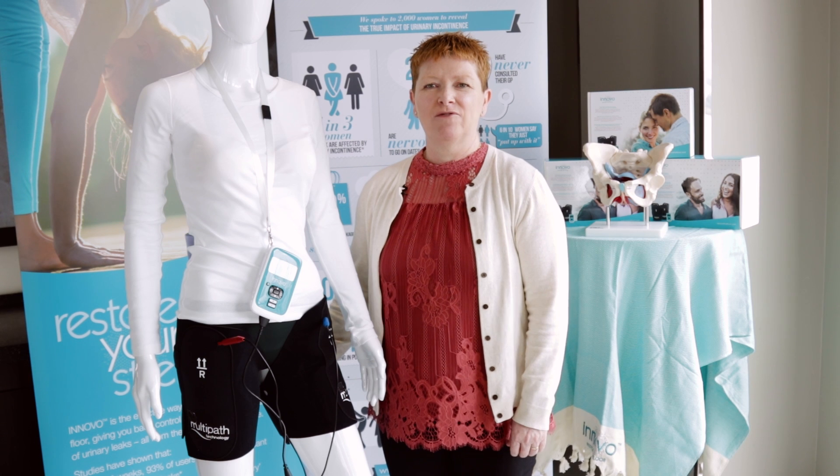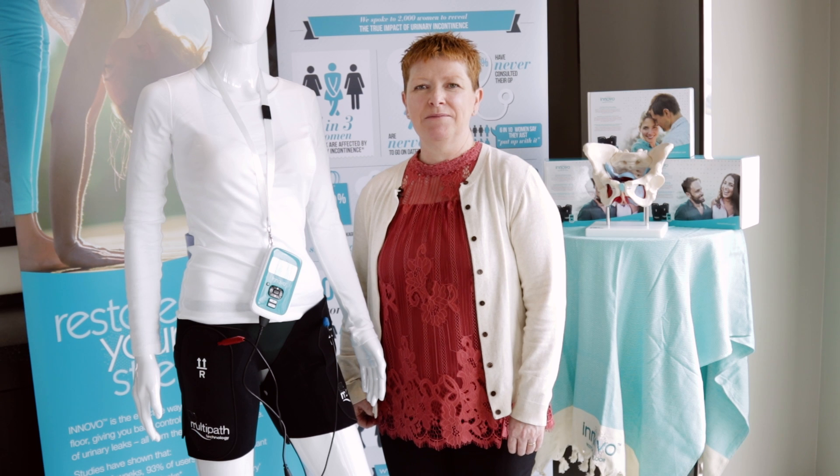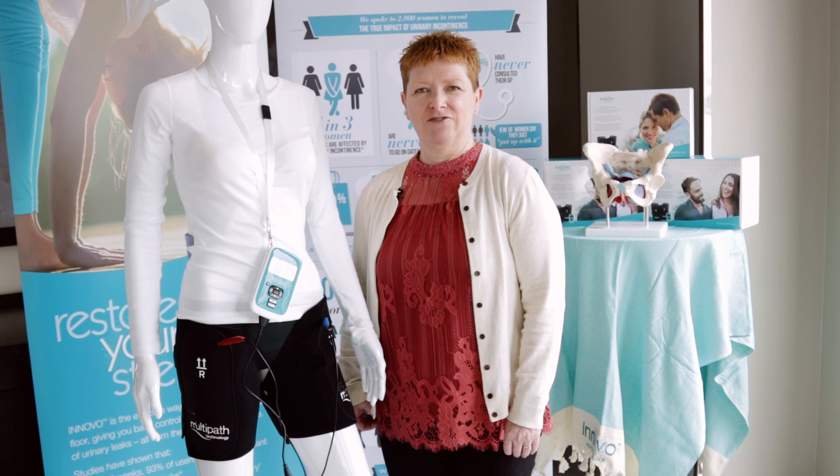We recommend using Innova therapy five times a week for 30 minutes. Research has shown that this is the optimum amount of time to use the device in order to strengthen the pelvic floor and reduce the symptoms of urinary leakage.